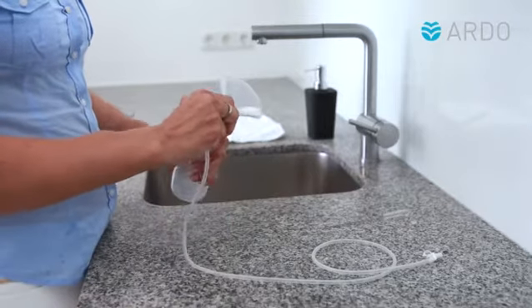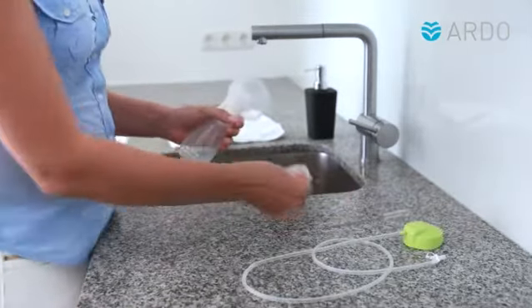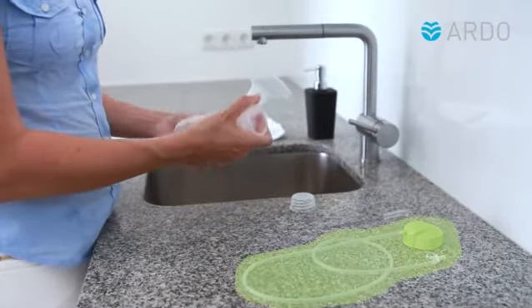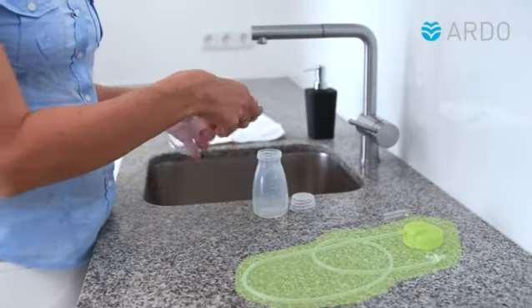First, disassemble the pump set into its component parts. Remove the cap together with the tubing and connector. Thanks to Ardo's vacuum seal technology, these three parts do not come into contact with breast milk during pumping.